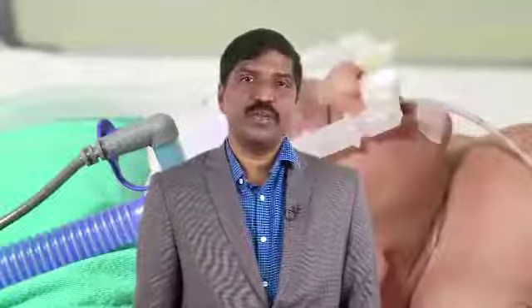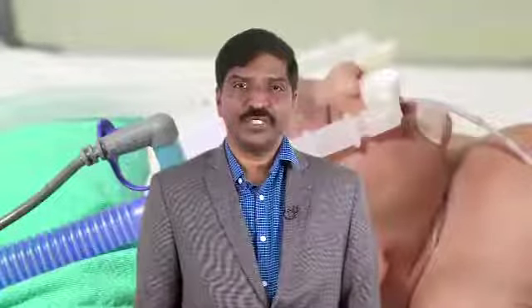The major problems one faces when using a CPAP machine are alarms and malfunctioning of the blender, leaks in the circuit, condensation and water logging in the circuit, and inadvertent delivery of high pressures. The alarms from the blender occur due to discrepancy in the gas pressures of oxygen and air reaching the blender. One needs to replace the oxygen cylinder or troubleshoot the air compressor to rectify the alarms from the blender. The blender needs recalibration once in every 3 months.